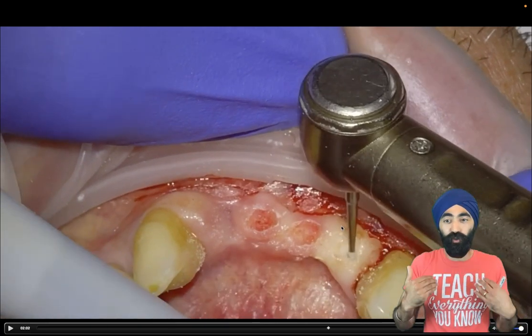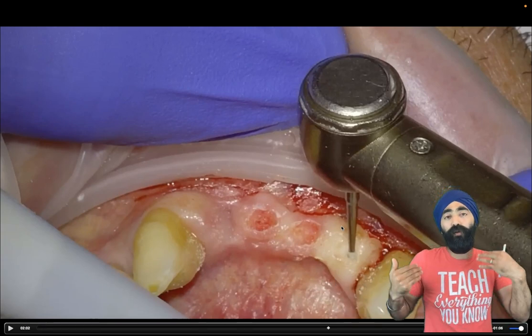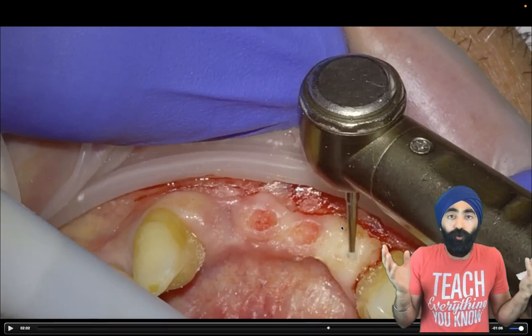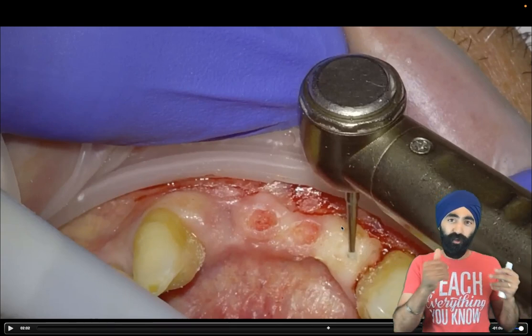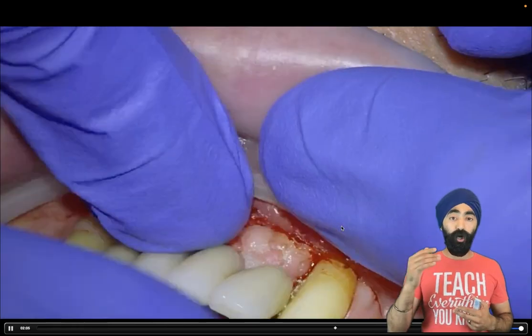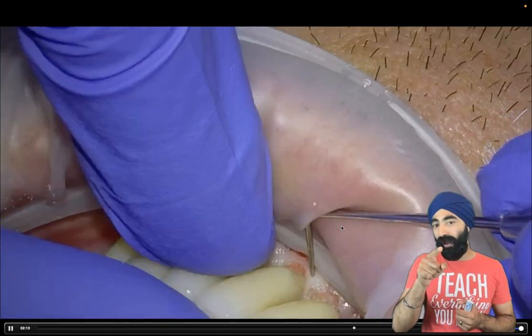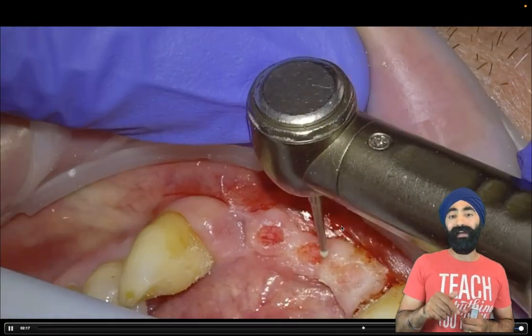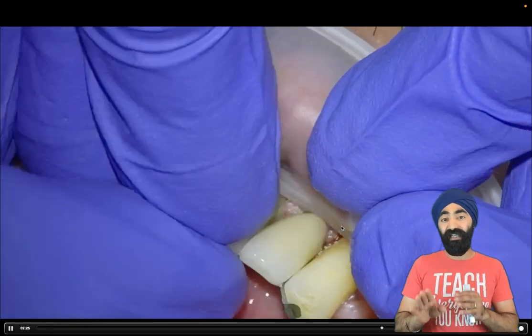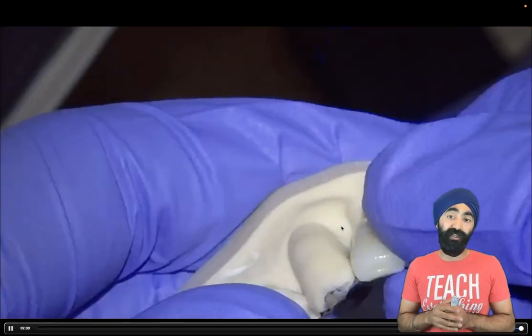The other option I had — if I didn't remove the soft tissue — was to adjust the pontic, i.e., drill some ceramic. But why would I want to do that? The whole point of going for these ovate pontics was for aesthetics, minimizing black triangles, and getting a nice emergence profile. It would defeat the purpose. Adjusting the ceramic is an option if you're not sure what to do, but instead I adjusted the soft tissues. Now I'm trying it in and it's feeling more passive. I can fully seat my bridge. I went back to make it a little wider to ensure the pontics are sitting very nicely against the soft tissue. And now it fits like it was on the model. I'm happy that I can continue to my bonding process.